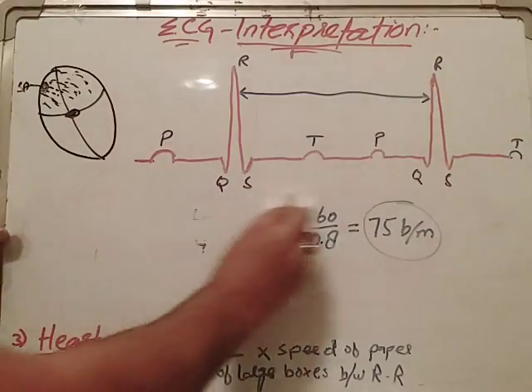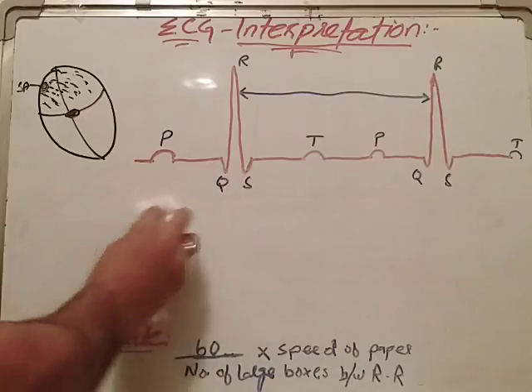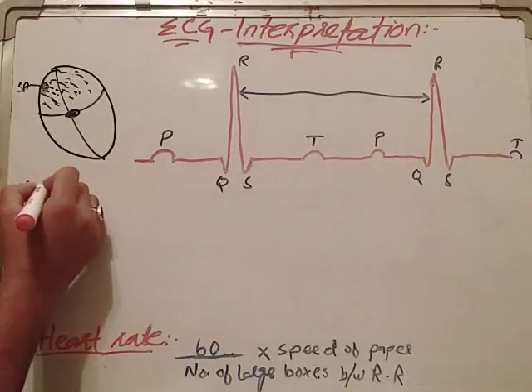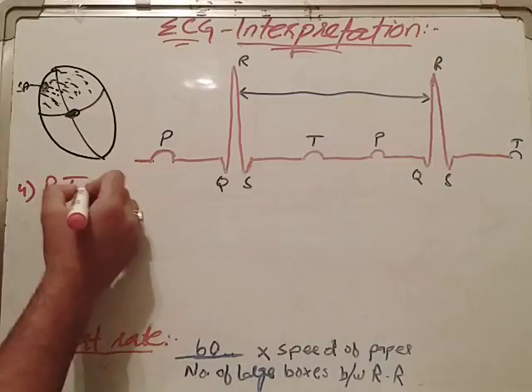And the next thing is the PR interval. The fourth is the PR interval, sorry, we may see the PR interval.